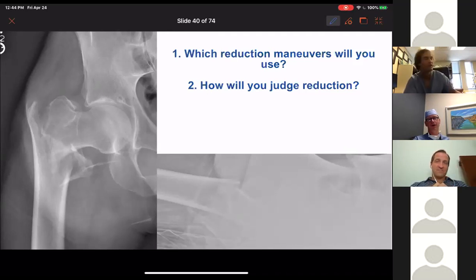I'm constantly obsessing on the position of the beam, the position of the distal fragment, trying to judge how much version I have now given them, and trying to interpret the multiple radiographic clues that I have. Other than a mishmash of that, I'm waiting for the method.